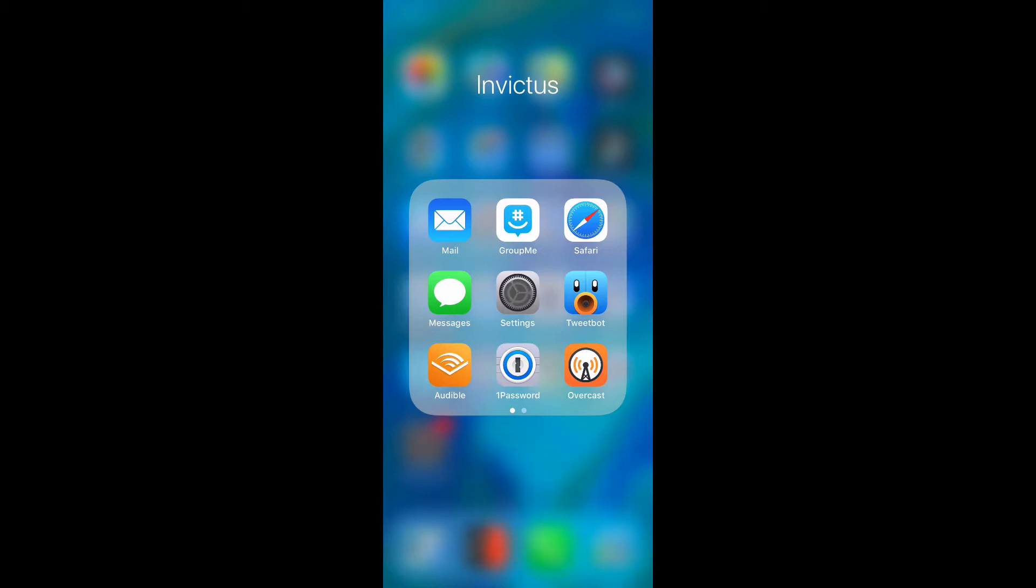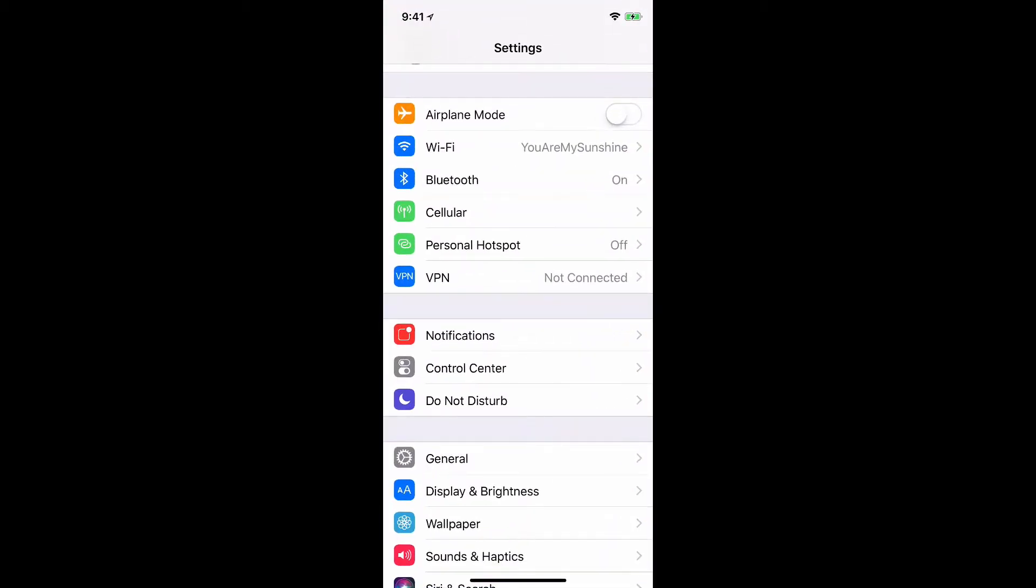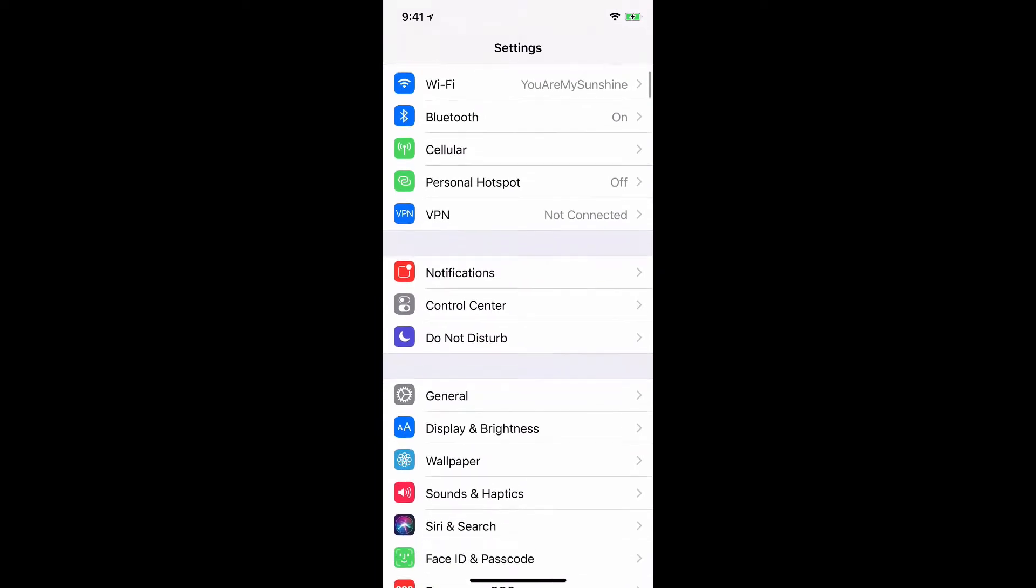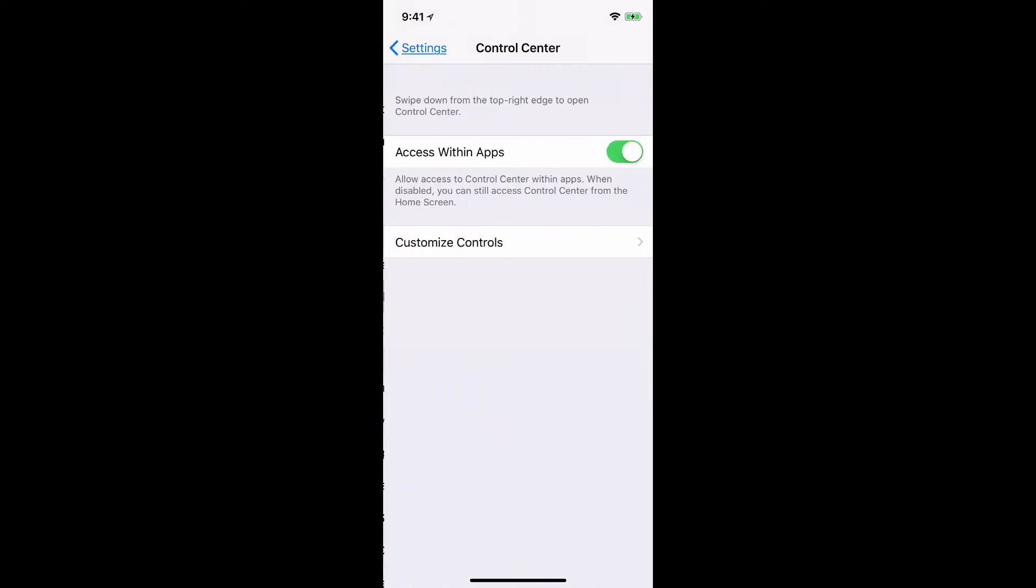First of all, I want to go to settings and then look for control center. I'm going to select that. I want to customize the controls.